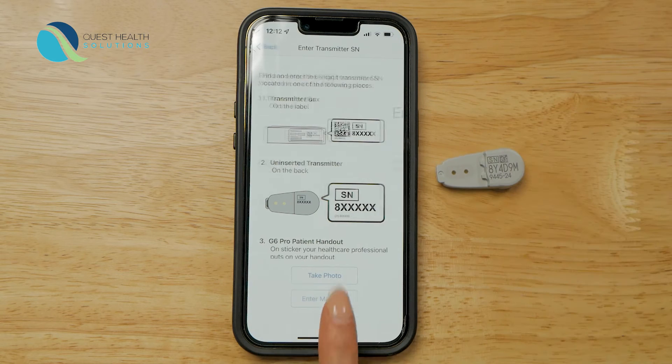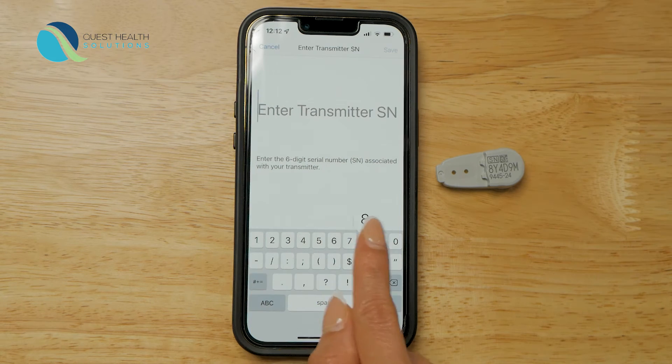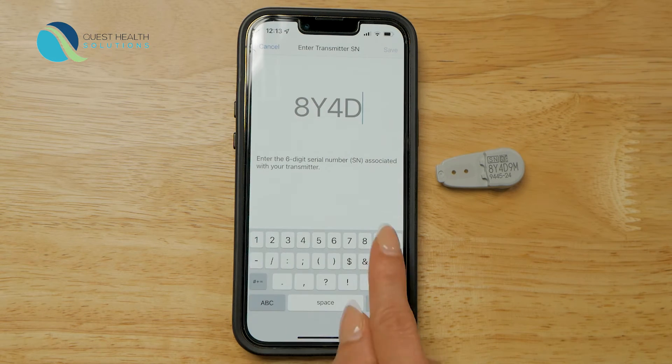Your transmitter and phone connect using Bluetooth. The app automatically checks to see if your Bluetooth is on. Next, you need to enter your transmitter's serial number. The serial number is on the back of your transmitter box.